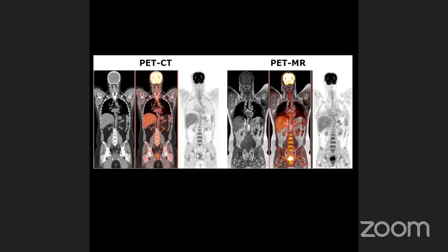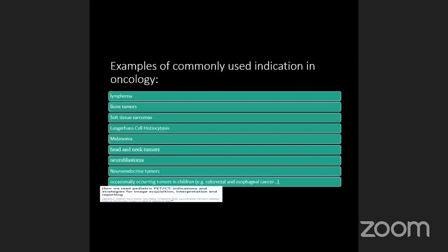So the PET images give you data, and the CT gives you data, and the fusion between both of them gives you data. So this is the benefit. Right now it has become more distributed in many places, even in Egypt and many other countries. You can see that there is PET MRI. Also, you get the benefit of MRI, the benefit of PET images, and the fusion between both. So this is hybrid imaging.